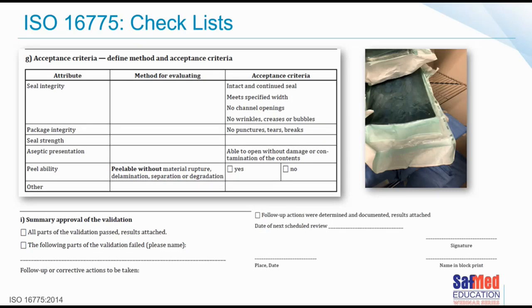This paper was published in 2014, by the way, the standard, of course. The other thing that matters is that this publication is busy being reviewed at the moment. I've had the fortunate pleasure of being able to look at the newer document, and the newer document even talks about the conditions of the environment in which we create the packages. You know that in many industries some of the work is done in a clean room, and we don't treat our CSSD like a clean room. And that little tidbit I gave you right in the beginning where it says you may not eat or drink, that comes from the new one.